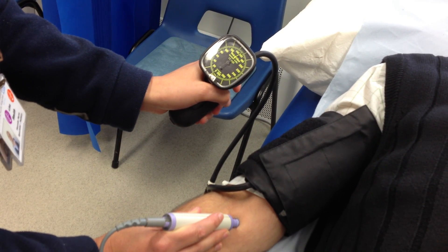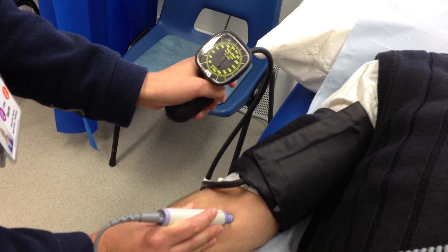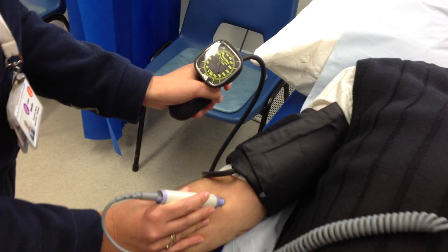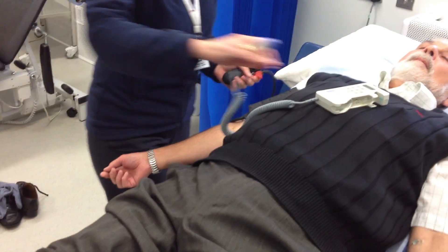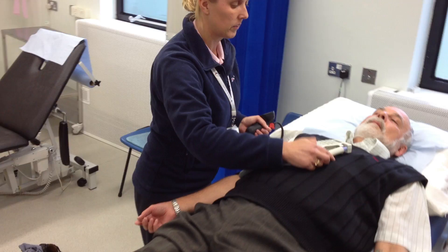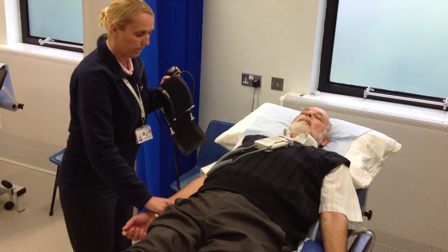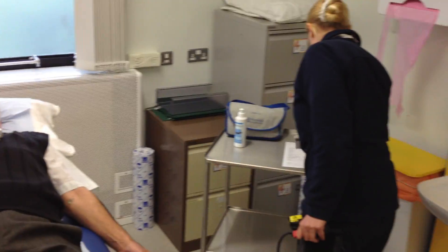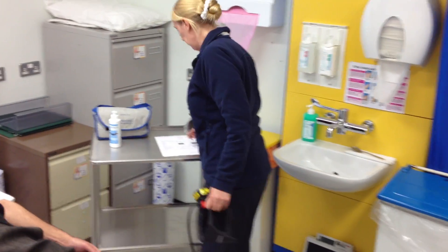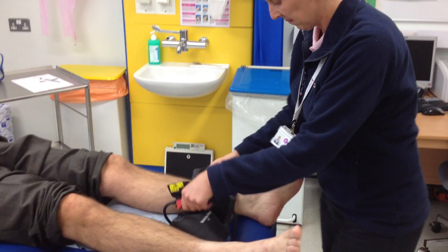The cuff has been deflated slowly until the first audible signal is heard. That reading will be used for the right brachial systolic pressure. Again, the result is recorded prior to commencing with the ankle pressures.